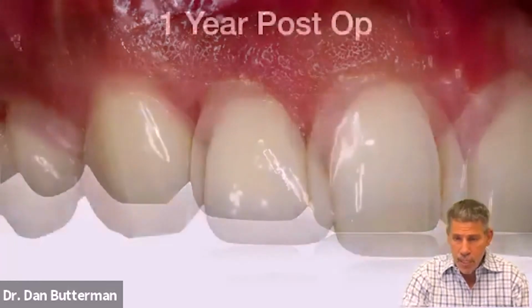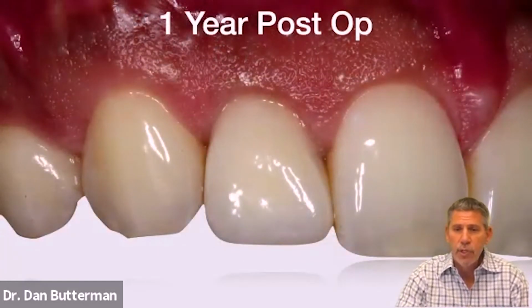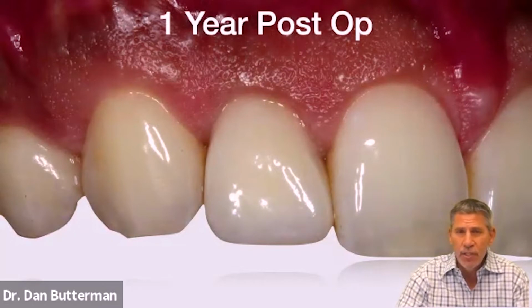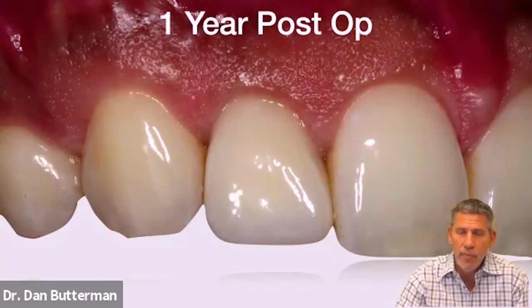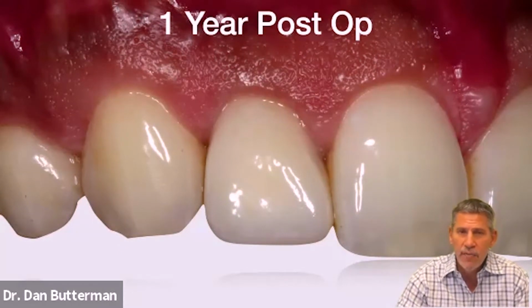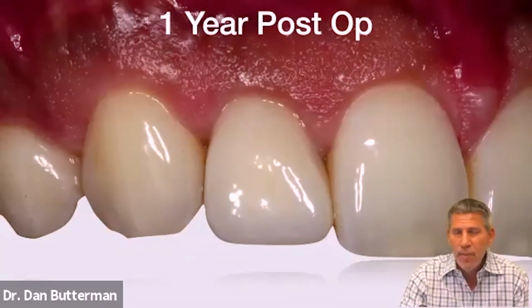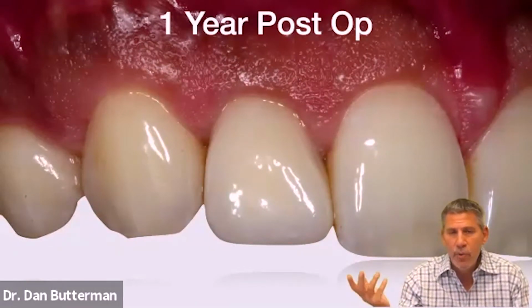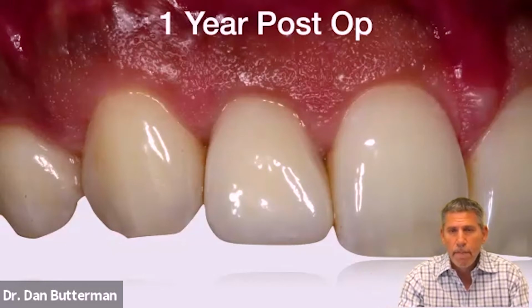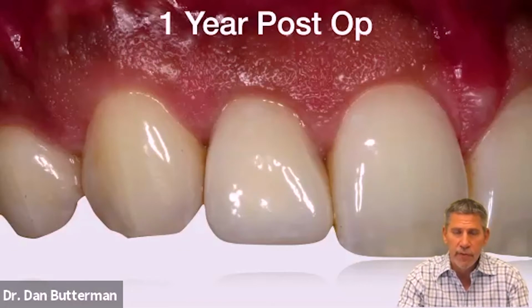And I threw this in because the patient literally just came back yesterday for his 1-year post-op, and it looks really good. The tissue looks good, and the color match and the aesthetics are good here. This is the kind of stuff that would potentially cost a lot of money to make, but the cost of that abutment that Atlantis made for me was about $200. The cost of the crown, since I made it myself out of the block, was about $23 or $25. Your lab, if you send them a digital file, they'll probably charge you quite a bit less for it than they would if you were doing a physical impression. But the fact that we can get these kind of results at this kind of a price savings is pretty phenomenal as far as I'm concerned.